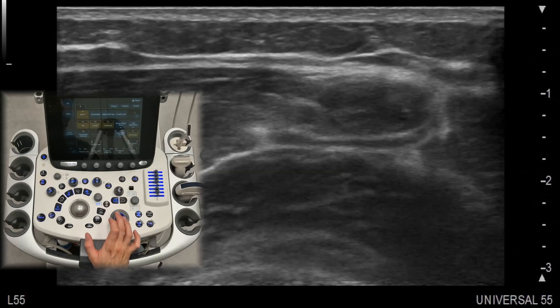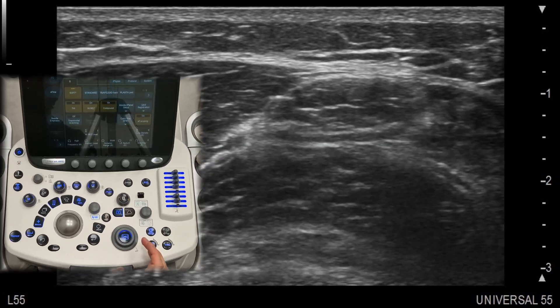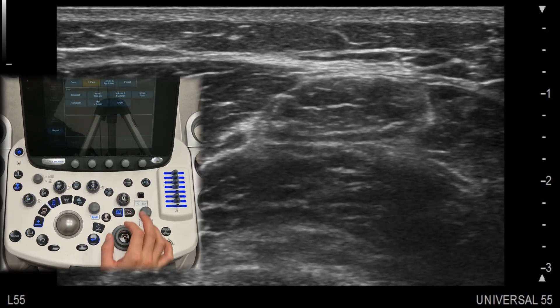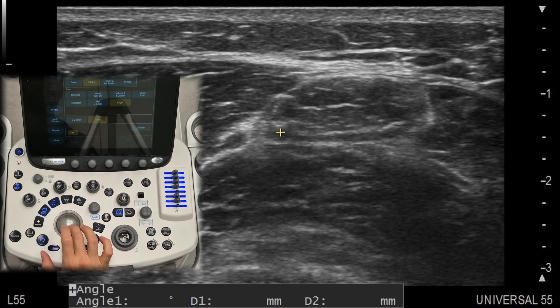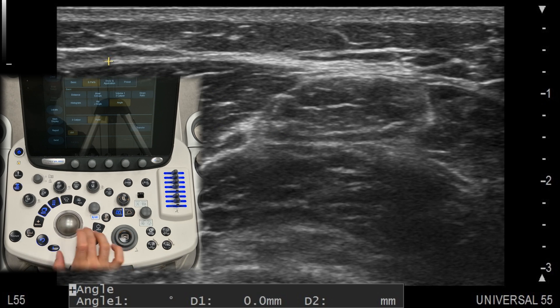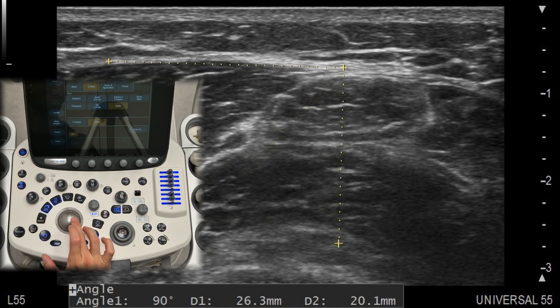The angle measurement tool is helpful when assessing joint angles or angles between anatomical structures. This can be particularly useful for MSK applications such as evaluating muscle fibers, pennation angles, or joint deformities. By placing three points at the lines of interest, the machine will calculate the angle between them.